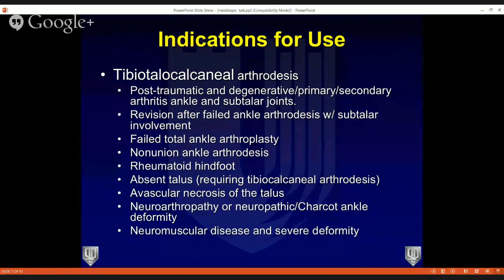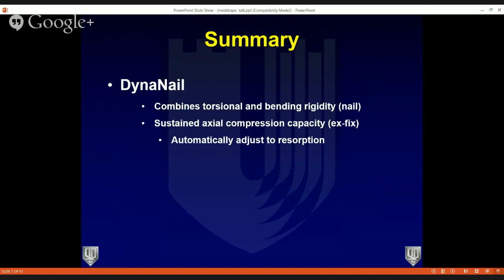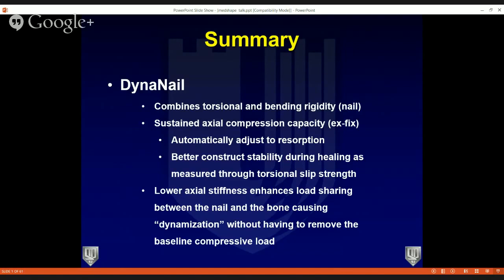This is a tibio-talo-calcaneal nail. You can do TTC fusions with it, use it in failed total ankle arthroplasties, rheumatoid hind foot, patients with absent talus — it is very versatile. The DynaNail combines torsional and bending rigidity like a nail with sustained axial compression capacity like an external fixator. It automatically adjusts for resorption, gives better construct stability during healing, lower axial stiffness enhances load sharing, and allows dynamization without removing the baseline compressive load.